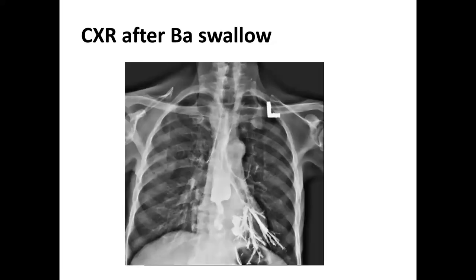So this one is the same patient, just showing the mainly affected lung. In this case, it is the left lung that is mainly affected, because you can see almost the whole lower lobe.